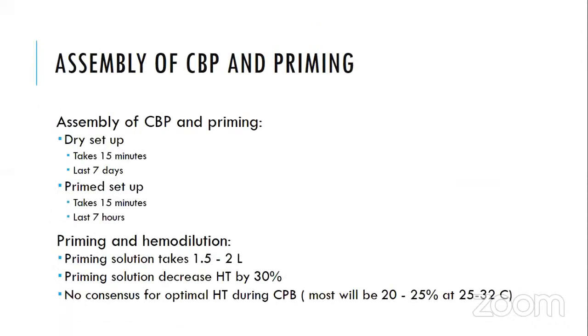Now coming to assembly of the pump and priming. Assembly of cardiopulmonary bypass and priming. Dry setup takes 15 minutes and lasts for 7 days, while primed setup takes around 15 minutes and lasts for 7 hours. Priming and hemodilution.